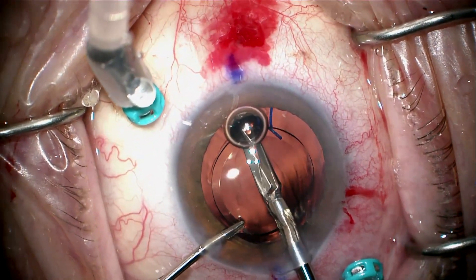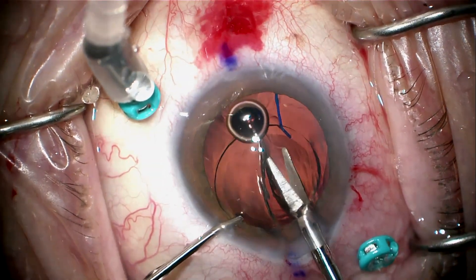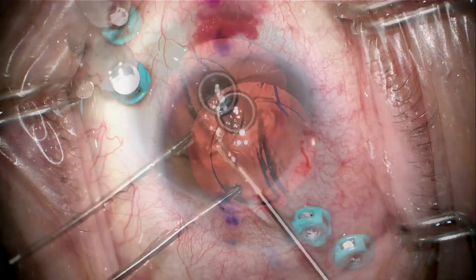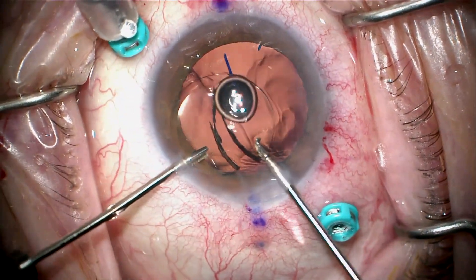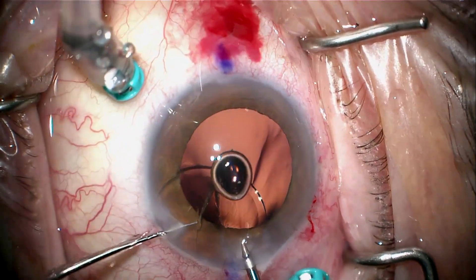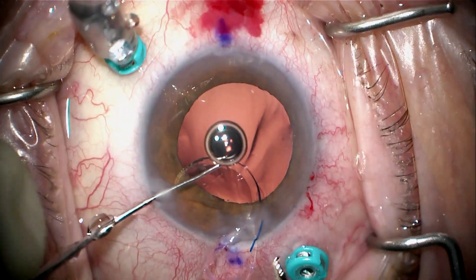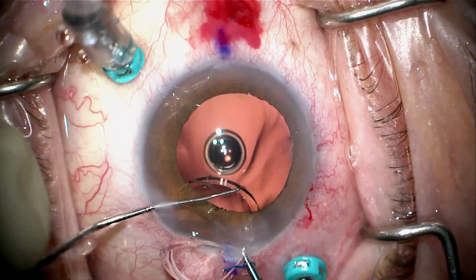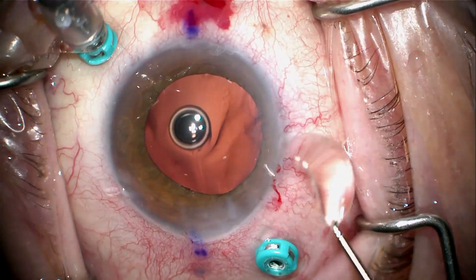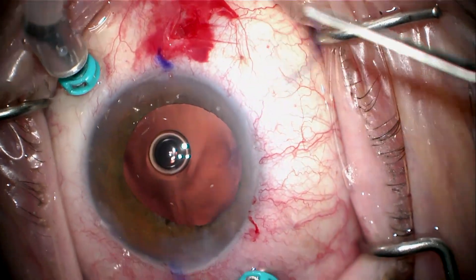I'm not going to cut the lens all the way through, or the other half of the lens will just swing back out of the way. So what I'm going to do is cut this partially — about 90% — and then snip the haptic so I can cartwheel this lens out of the eye without worrying about the other half falling back. Once I take the lens out in this fashion, I can then go and pick the haptic out on each side.